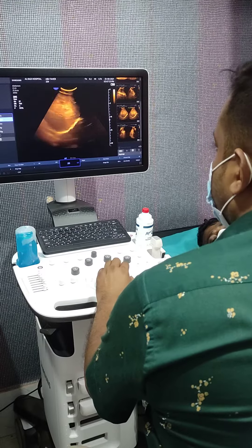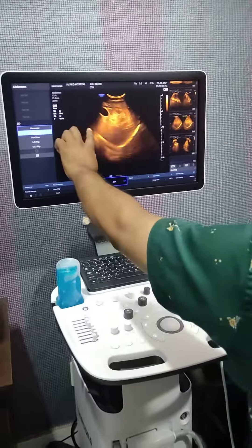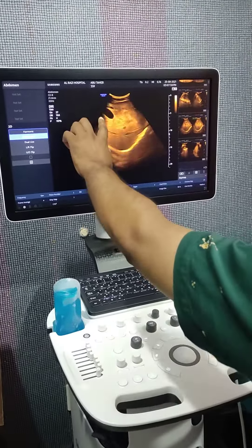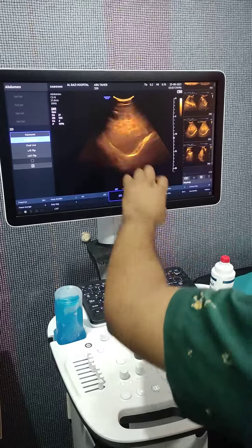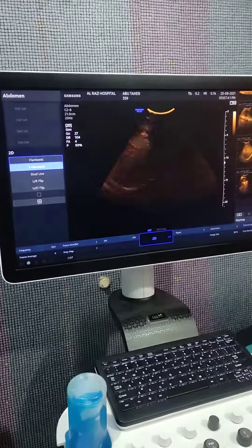On ultrasound, this is the right lobe of the liver, gallbladder, and this is the left lobe.